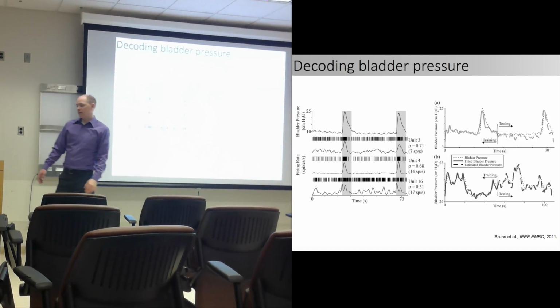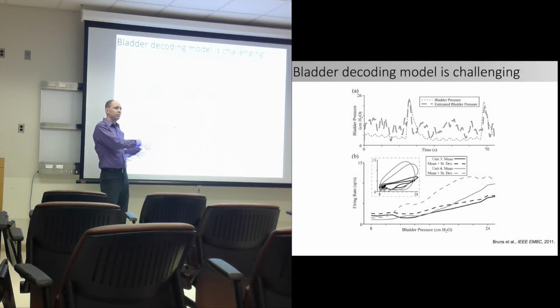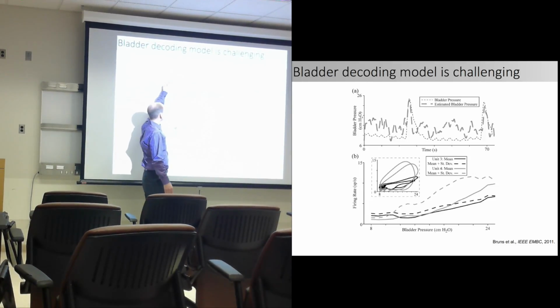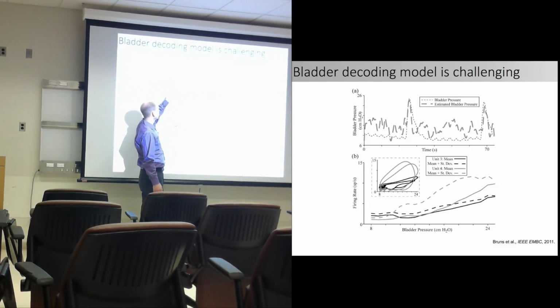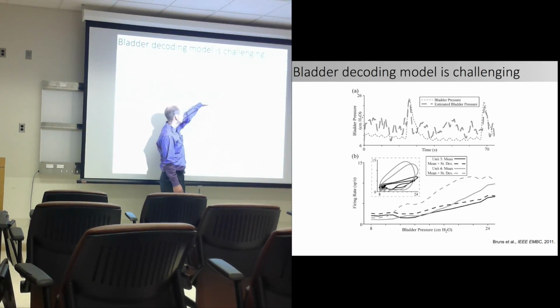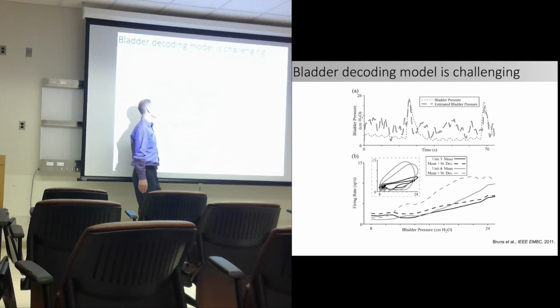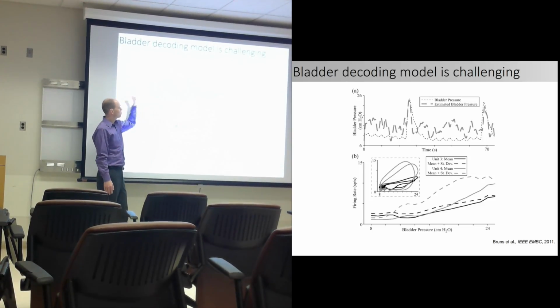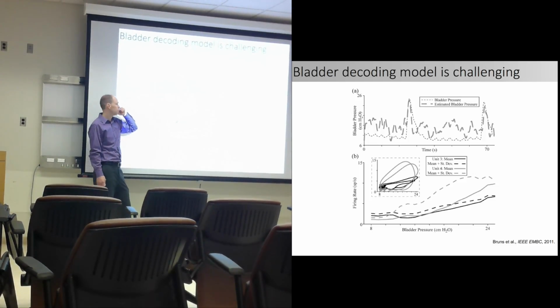But in scenarios where we take a recording in one period of time and, an hour or two later, try to use the same model, it wasn't quite as successful. So here is the estimated pressure using a model from earlier in the experiment compared to the actual pressure. The baseline pressure is pretty noisy, although we did catch the larger bladder contraction. So even in a somewhat noisy scenario, we might still be able to detect it from that comparison. Not as good as you might like.